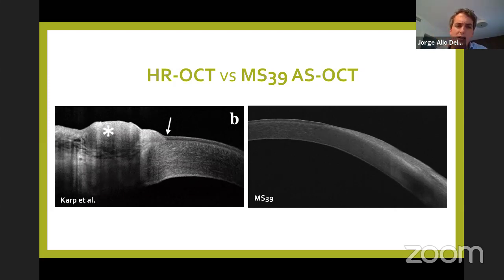And we can see that, of course, here we still have some high resolution, but we are not that far from what they call the ultra high resolution anterosegmental OCT. Now we have a very high resolution anterosegmental OCT, and we actually can now use this knowledge in order to do the differential diagnosis and management of these lesions.